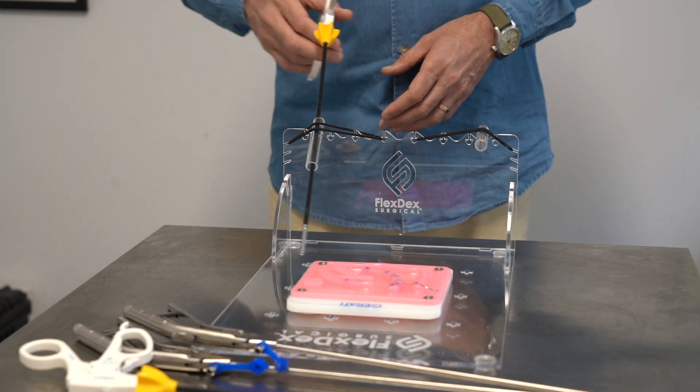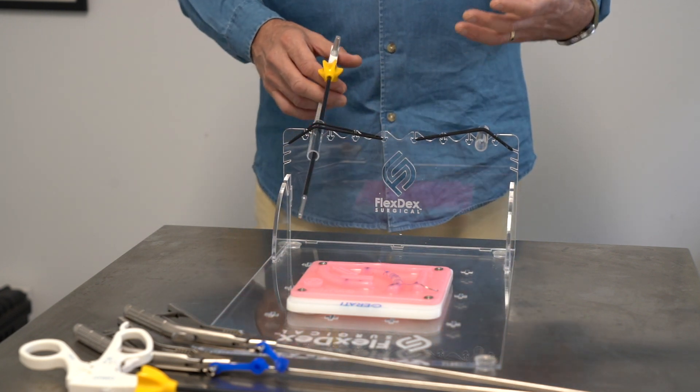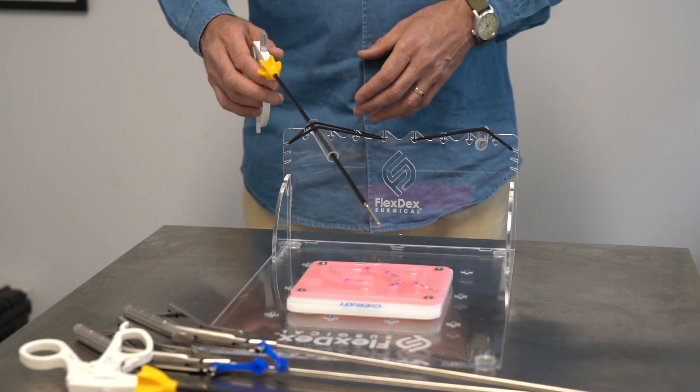And so all of these movements are reversed, but again with practice they can be achieved with great skill and precision.